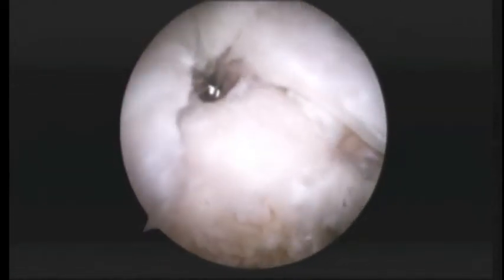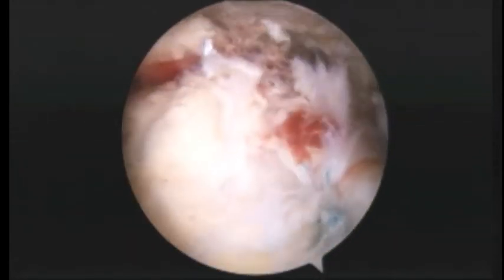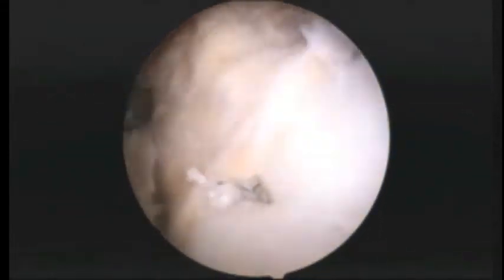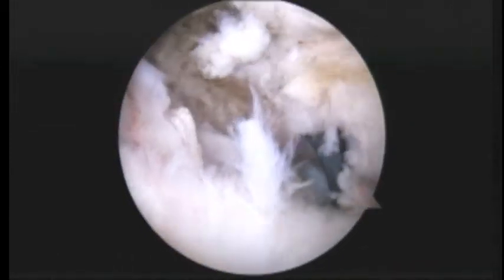Here's the repaired tear. That looks really good. You can see our ripstop stitch and how we're behind it right here. Okay, so I'm happy with the way that looks. And the last thing we have to do is tie the sutures for the biceps. So we'll get that done and show you some more in just a minute.